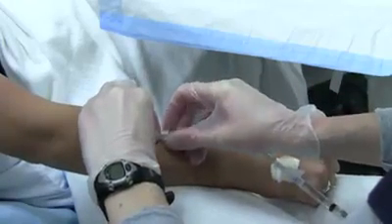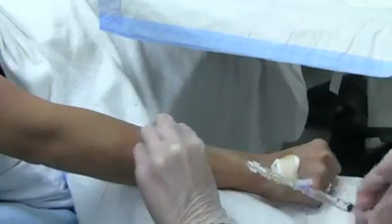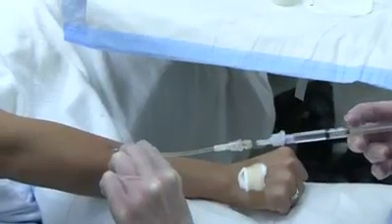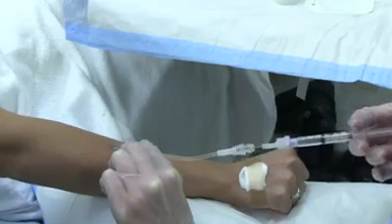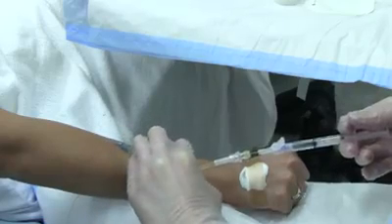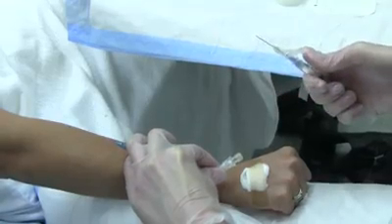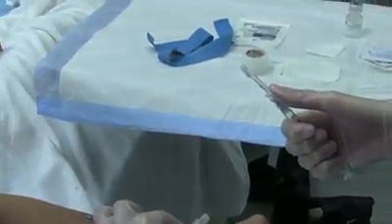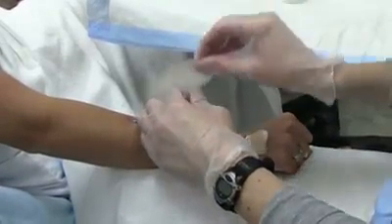If a hematoma occurred, release the tourniquet, remove the needle, and apply pressure. When saline lock is attached to the hub of the catheter, flush the catheter with normal saline to ensure a smooth flow. Place sharps directly into sharps container. Tape the catheter using a tegaderm.